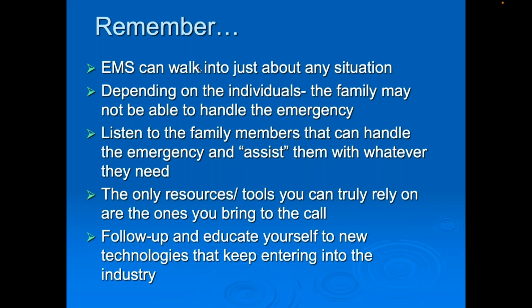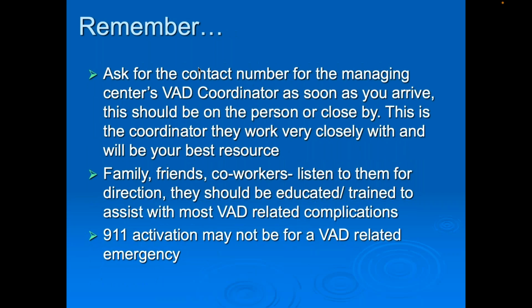With this being said, know what patients you have in your catchment area who actually have a left ventricular or a ventricular assist device of any sort. Ask for the contact number for the managing center's VAD coordinator as soon as you arrive. This should be on the person itself or close by. This is the coordinator they work with very closely and will be your best resource.